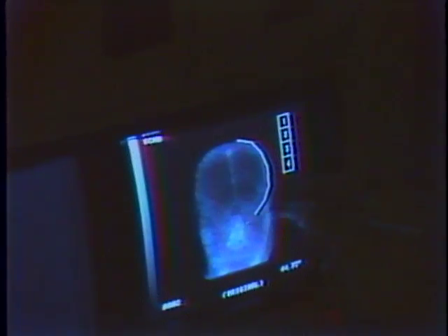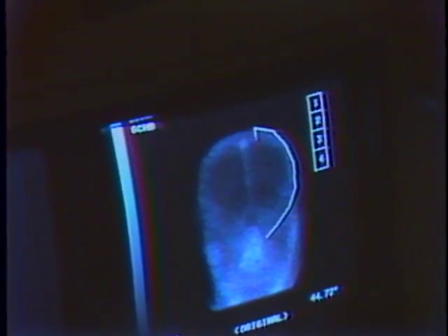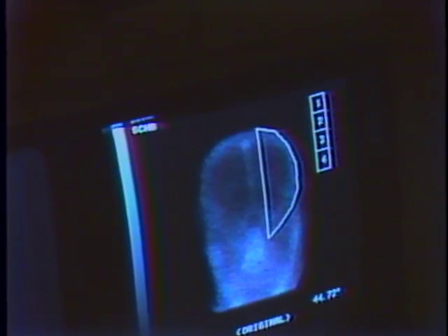There are a number of ways to process the information that you get from the gamma camera. One way is to just make images like we saw with the multi-formatter. The other is to send it to the computer. The computer can process it and tell you how much, not just where, like the photographs tell you.